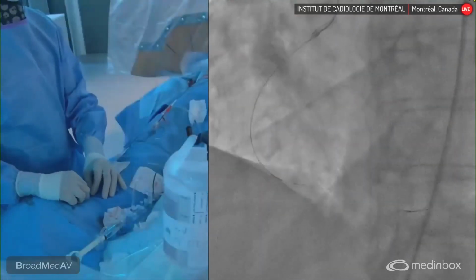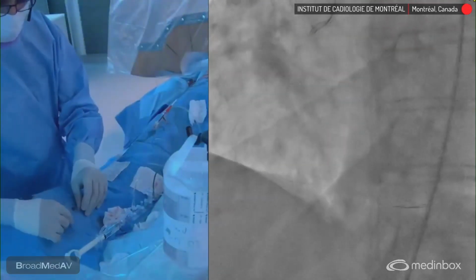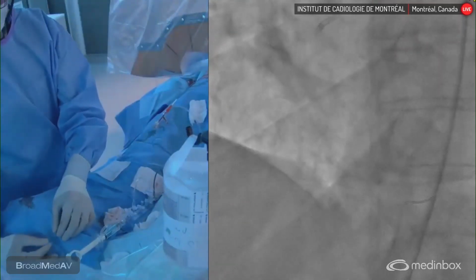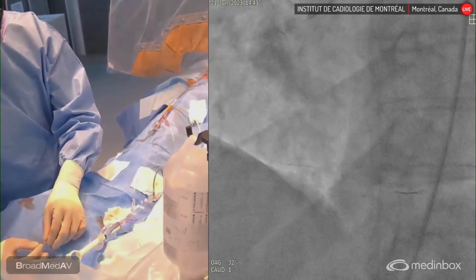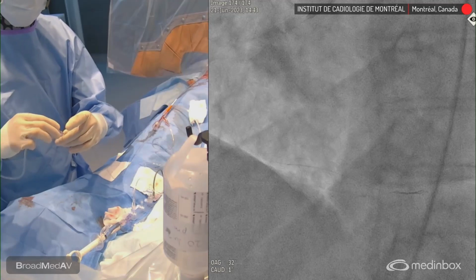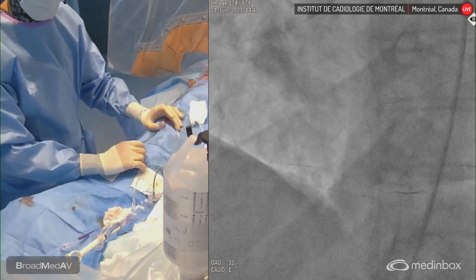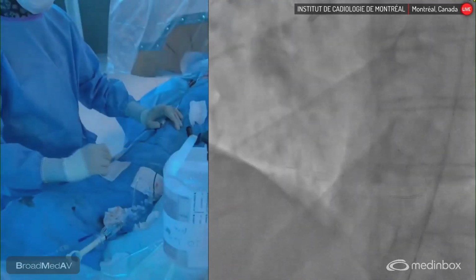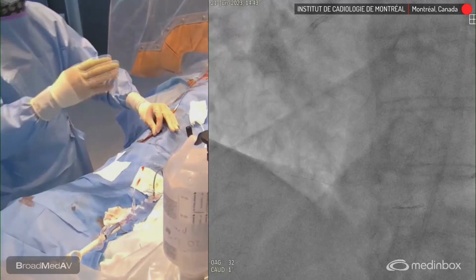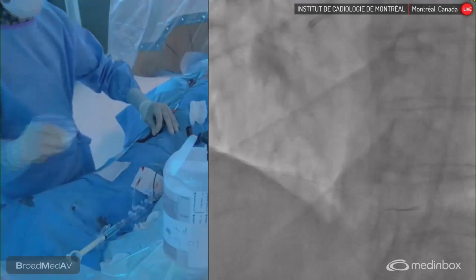How do you remove the microcatheter at this stage? So there are multiple ways you can remove the microcatheter. You can either trap, you can hydroglide, or if you have a Trapliner, you can use the Trapliner. I think in this case, we will do a hydroglide. The way to do that is make sure the tip of the microcatheter is full of dye. You lock it, make sure you don't trap the wire. Then your colleague inflates at a high pressure and keeps it at the same pressure while it comes out. And it comes out and nothing moves and you can look at the wire. I have a knuckle at the workhorse, so it's pretty safe.